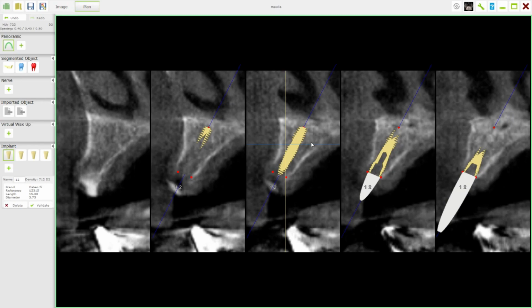And again, you'll notice in our video that follows this that the site former is actually used at one point to confirm the angle of our implant, and also the implants are placed by using a slight tapping technique with a mallet to tap them in, again because the bone was considered not to be that dense. So by looking at the D value, it will also determine your placement protocols.